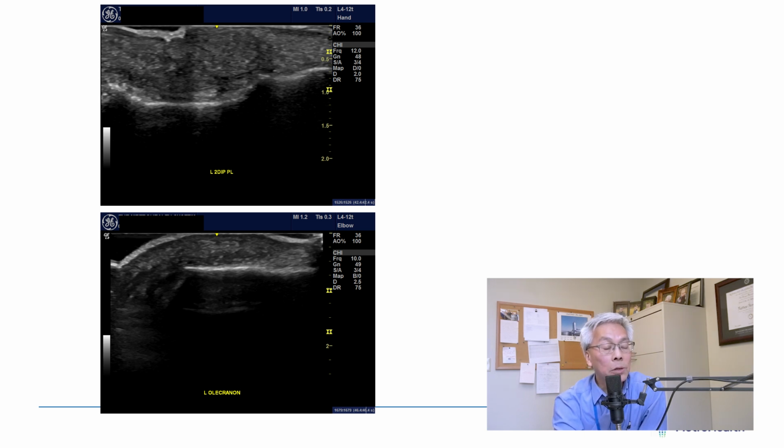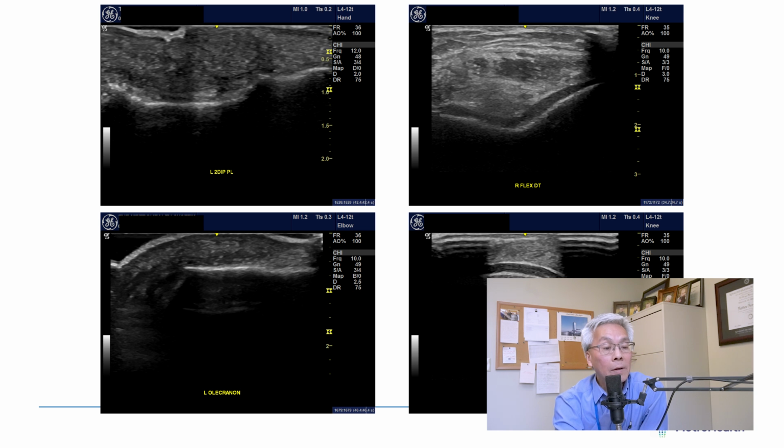However, when we look at her knee, the transverse view shows a little better double contour than the patient I just showed you. And on the long view, it shows a pretty nice double contour. Obviously, she has tophaceous gout, so this is sort of embellishing, but nonetheless, these are the ultrasound findings.